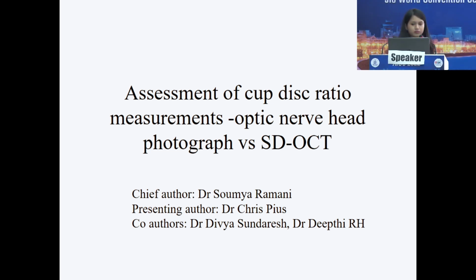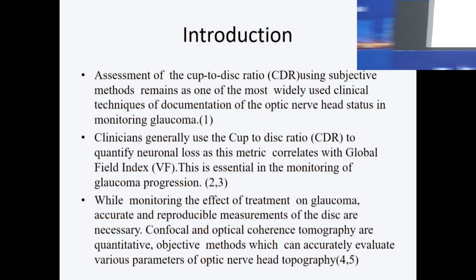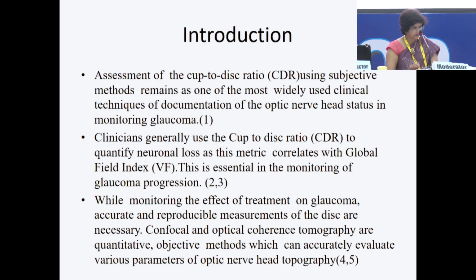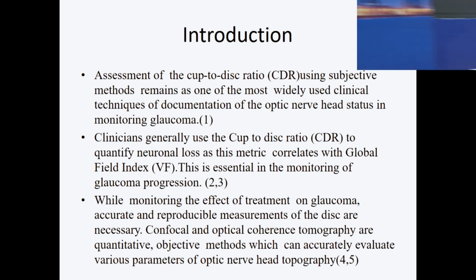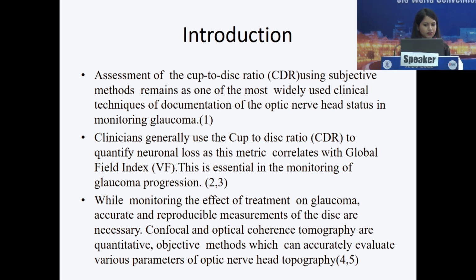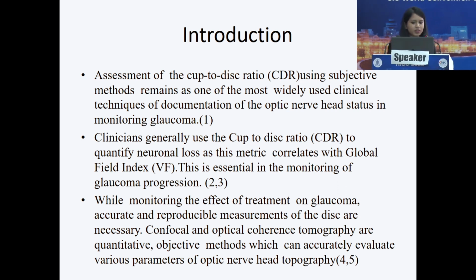On assessment of cup disc ratio measurements, optic nerve head photograph versus SD-OCT. Good morning. The assessment of cup to disc ratio using a subjective method is one of the most widely used clinical techniques of documentation of the optic nerve head status in patients with glaucoma.